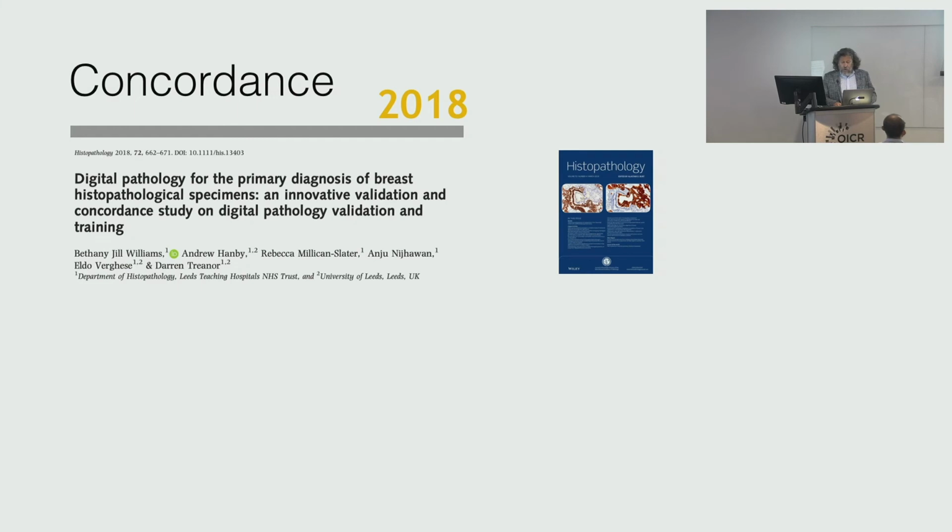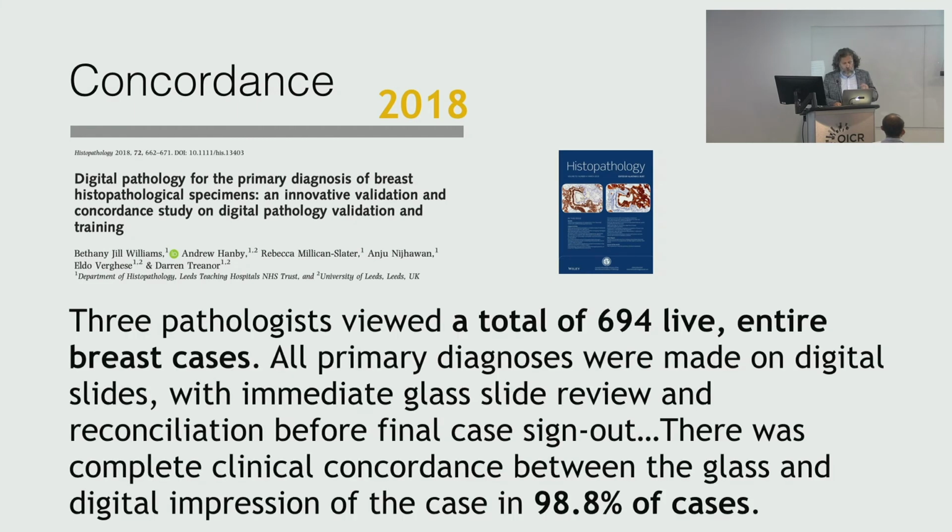There are many other studies, and I just grabbed three more or less randomly to show. In one, 694 entire breast cases showed a concordance of 98.8%. Very impressive. Again, it depends on what primary site you're looking at, how complex the tissue is, and how complex the manifestation of the malignancy is. Then you may get lower or higher concordance.